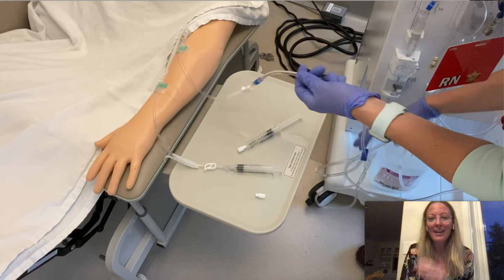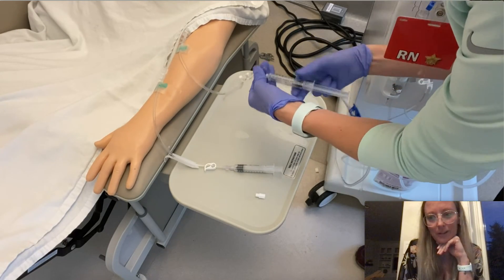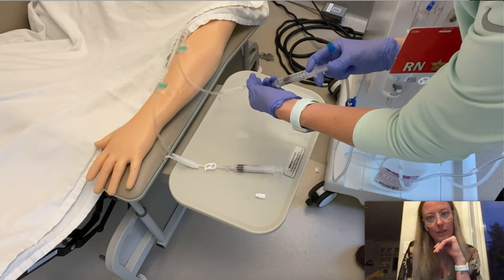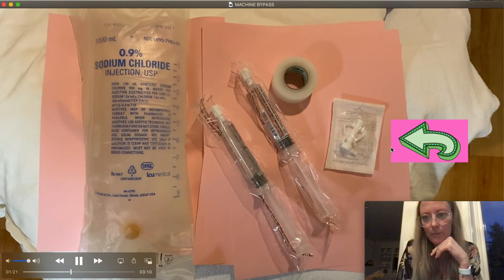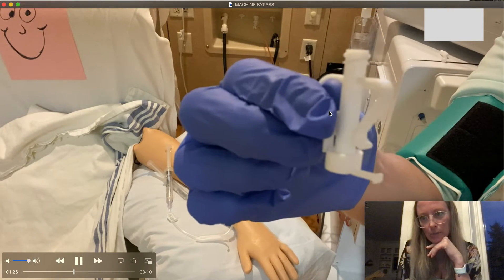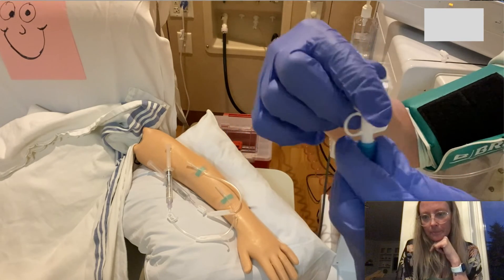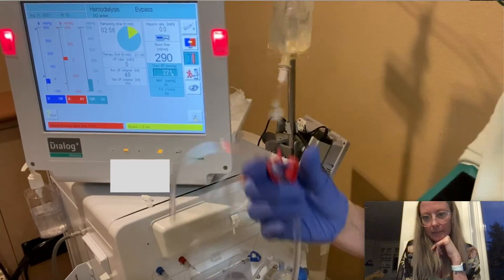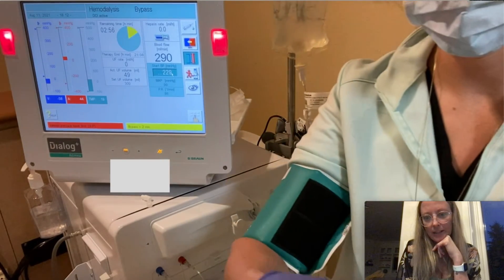Once their blood is rinsed back and I have a good blood pressure, I am now going to clamp my venous lines and flush the venous line. This is where I grab the recirc. I have got the recirc here — a little slow-mo action for you. I will connect it to the blue, unclamp the blue clamp, grab my red line and clamp it, disconnect it, and connect it to the recirc.